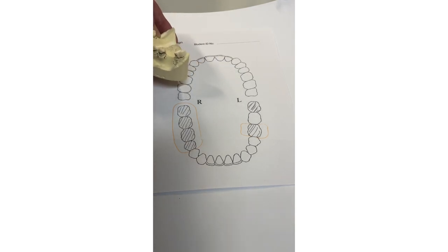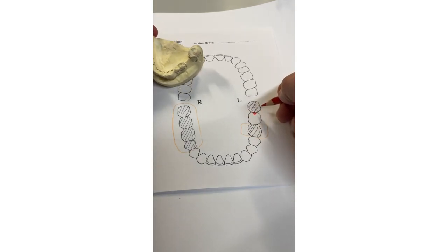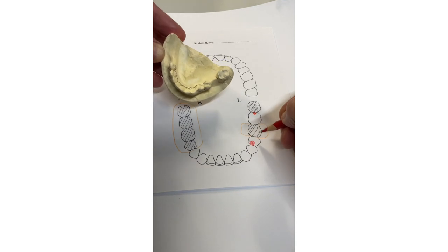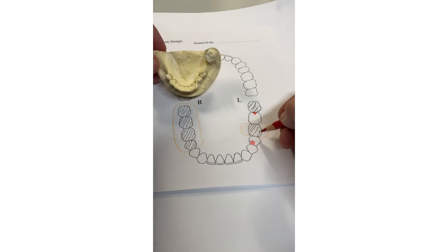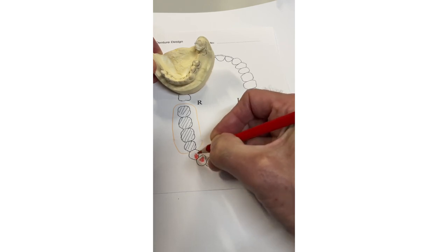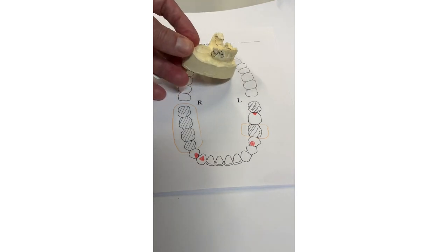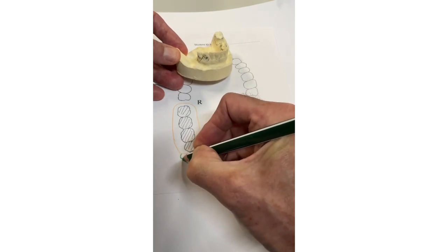Two saddles — first thing you want is support. We've got a mesially inclined molar so we're going to rest distally to actually load the tooth axially. The premolar is rotated a bit so it's easier to get to the rest mesially — purely for ease of access. On the other side we've got a long free-end saddle so we're going to rest distally because there's probably more bone there, and because of the length we'll also put an additional rest on the canine, which will probably require a composite build-up. You've now supported it as best you can.